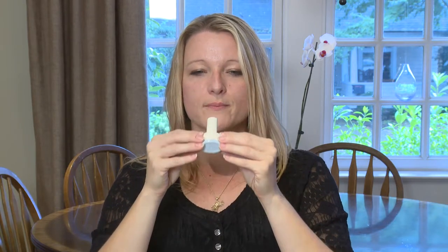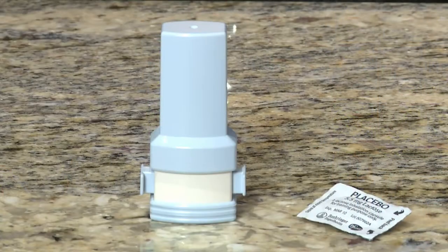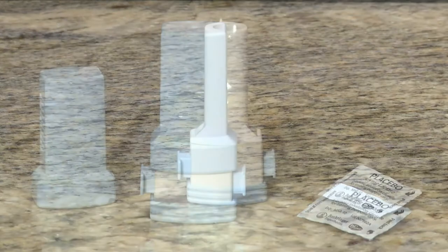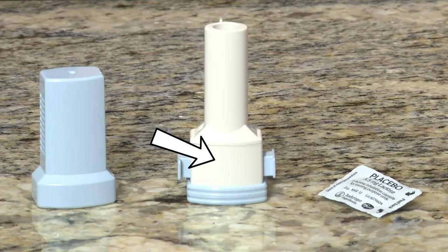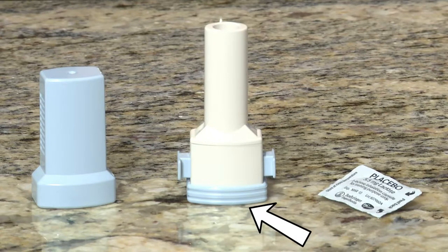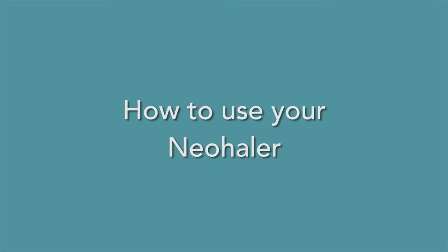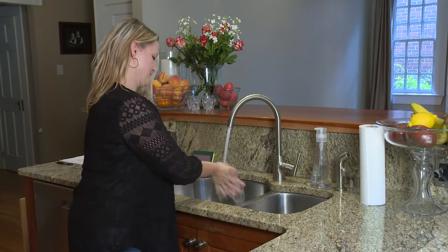This video will show you how to use your neohaler the right way. The neohaler takes dry powder medicine in capsule form. It comes in a blister pack. When it is closed, the lid keeps the mouthpiece clean. The capsule chamber holds the medicine. The two piercing buttons open the capsule and release the medicine. You hold the neohaler by the base. The mouthpiece is where you breathe in your medicine.